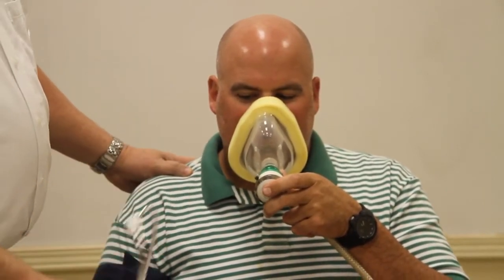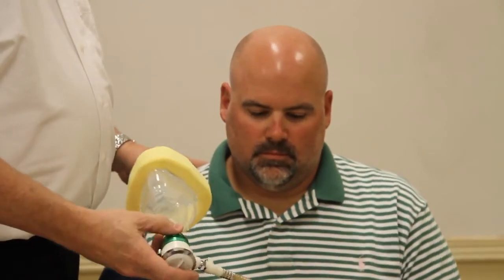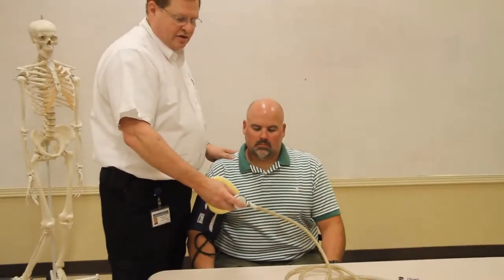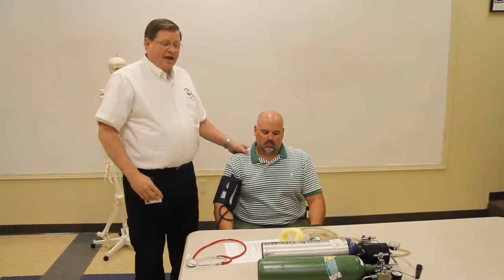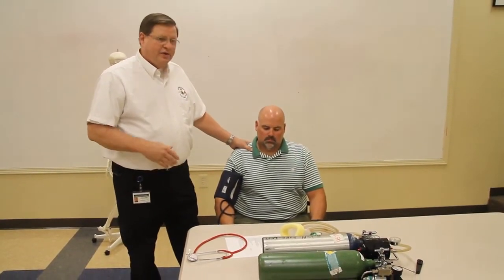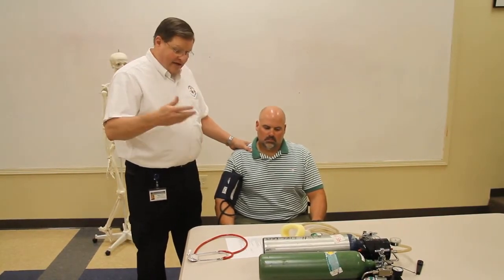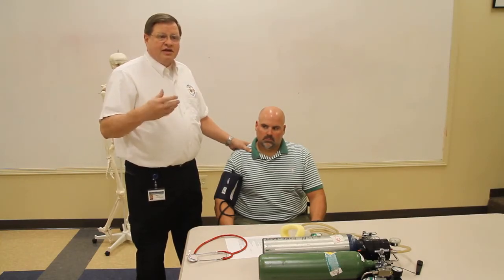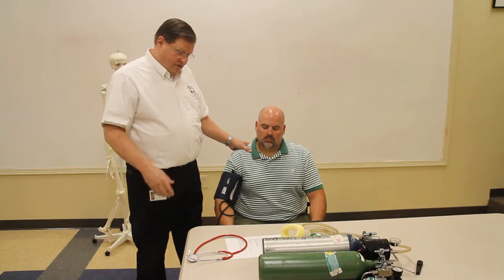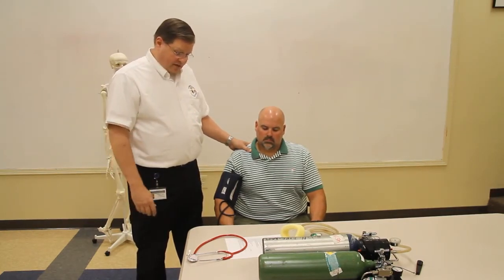Now, we administer the nitrous oxide until he either feels better or until he drops the mask. Once that happens, then you are finished with the administration. After the administration is finished, we have to make sure that we have good documentation. We're going to document his age, his gender, his indications for use, why we used it, and also who we received orders from to use the nitrous oxide.